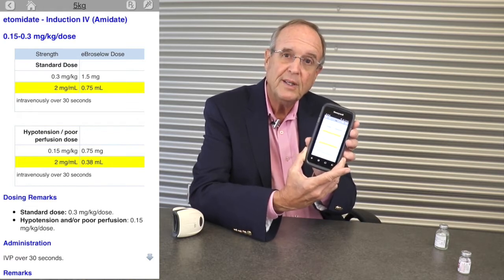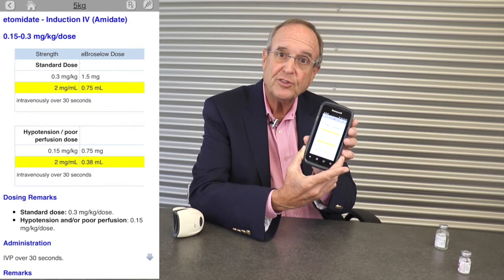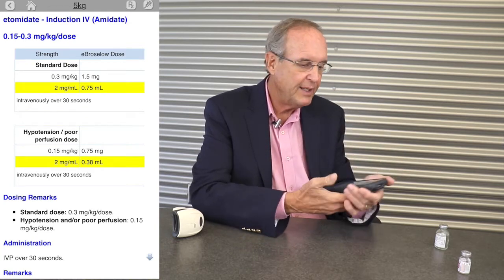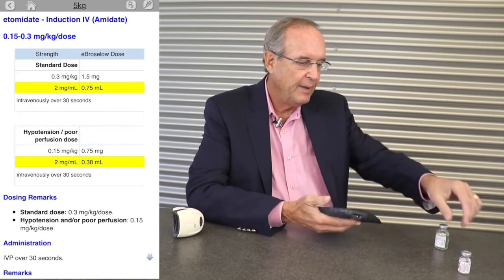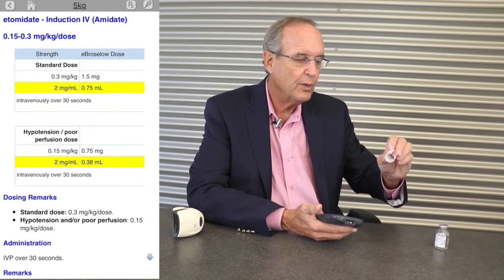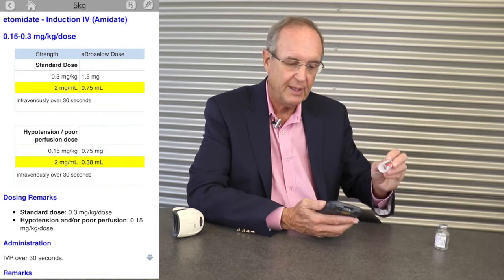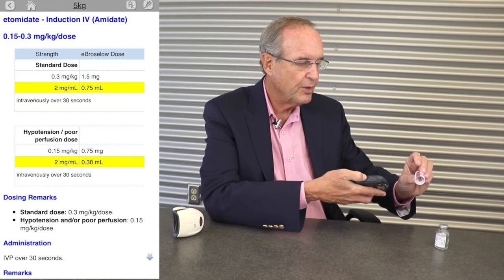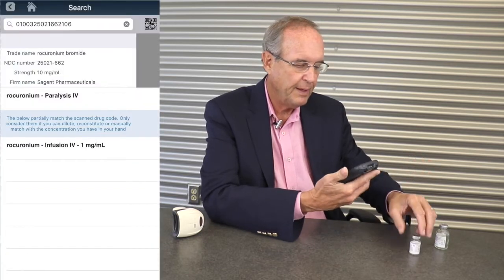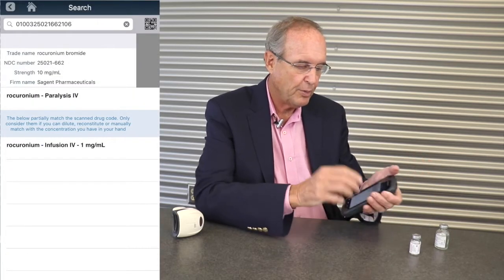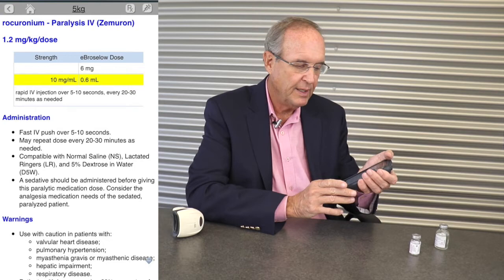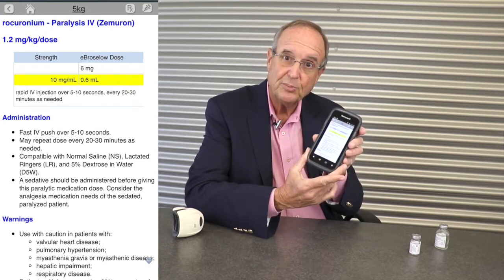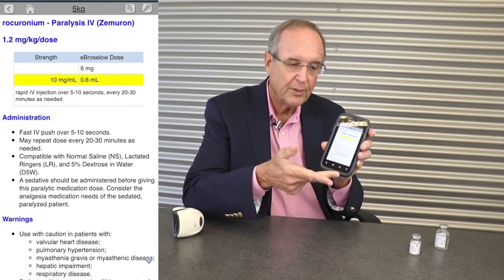It also prompts me for a hypotensive dose in milliliters. Once I've scanned the Etomidate, I want to give rocuronium as my paralytic. I scan the barcode on the rocuronium, pick paralysis as the indication. As you can see, the dose is 0.6 milliliters, with guidelines shown below.